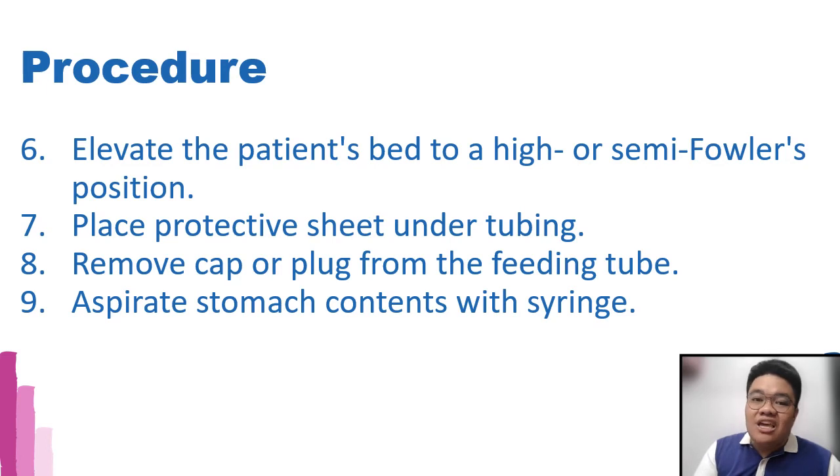But class, if the fluid is more than 100 ml in the stomach, we need to inform the physician before we do our feeding. There will be instances that the feeding would be placed on hold because the patient might not be digesting the fluids or the food products properly.